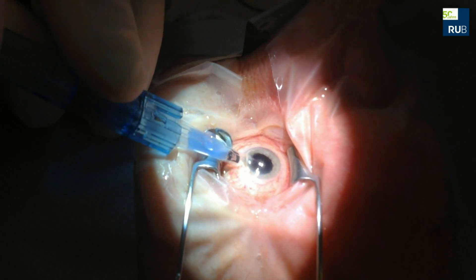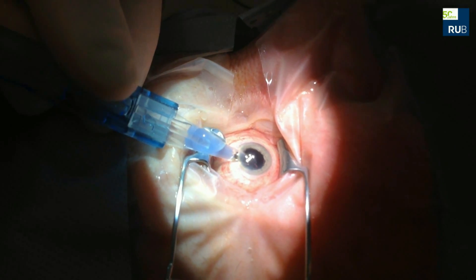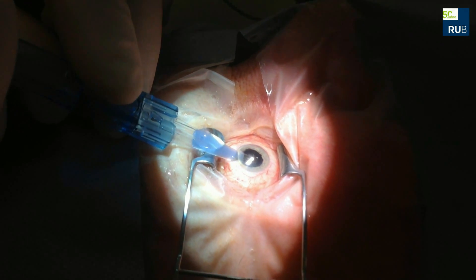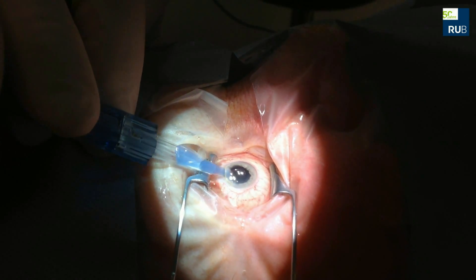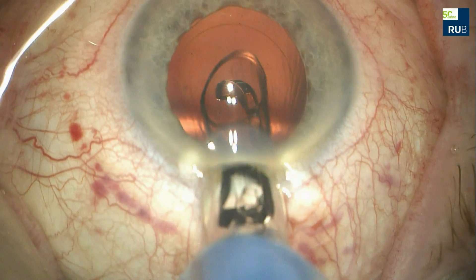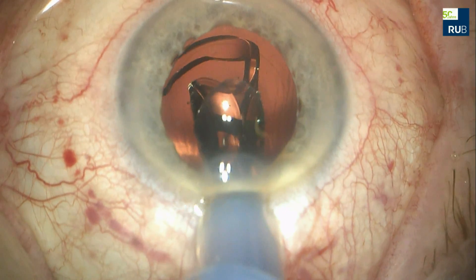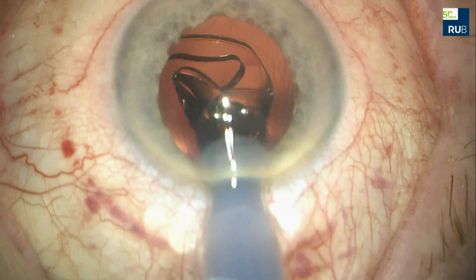This assists in the tucking of the leading haptic of the IOL. The IOL is now being inserted into the eye. The tip of the cartridge is placed into the incision and the IOL is advanced slowly for a controlled release into the capsule. Care must be taken not to advance the soft tip beyond the tip of the cartridge.